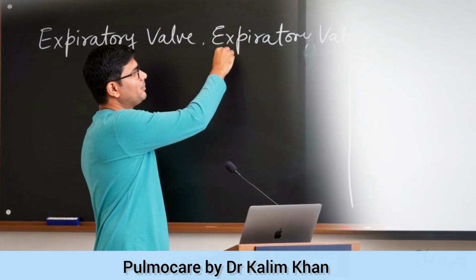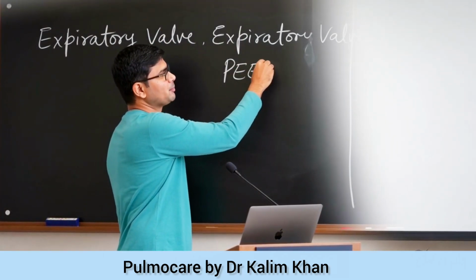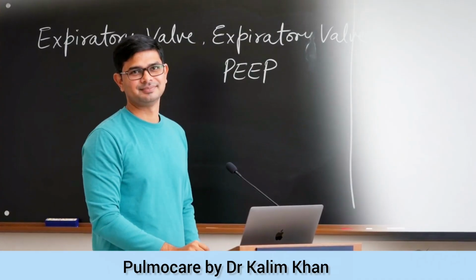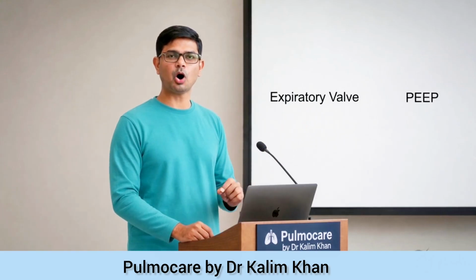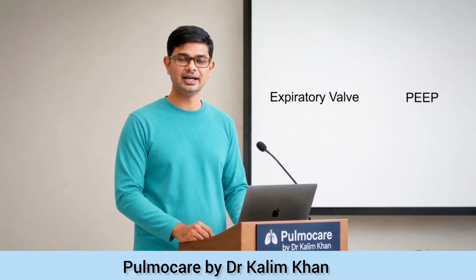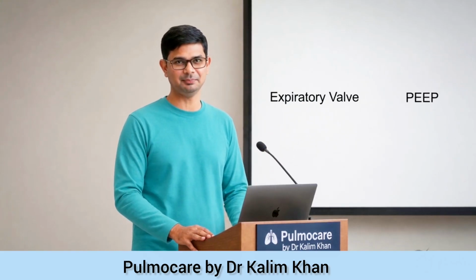PEEP prevents airway pressure from simply returning to atmospheric pressure at the end of expiration. The ventilator uses its expiratory control system to maintain the desired level of PEEP. Therefore, problems with the expiratory valve or circuit can affect both ventilation and PEEP.